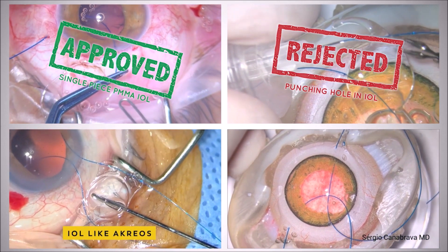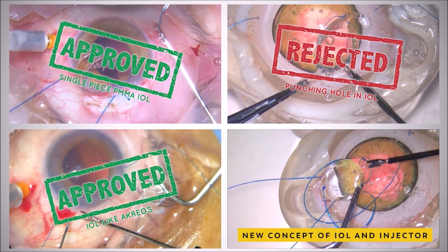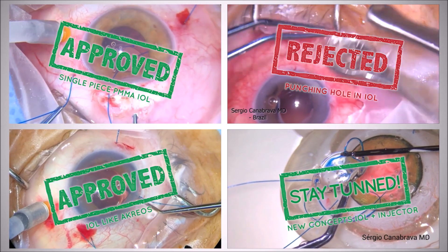The surgeries that were made with Acreos or similar IOLs have shown to be stable, and a test in a wet lab with the new IOL and the new injector will happen in the following period to come. We intend to present the results soon.